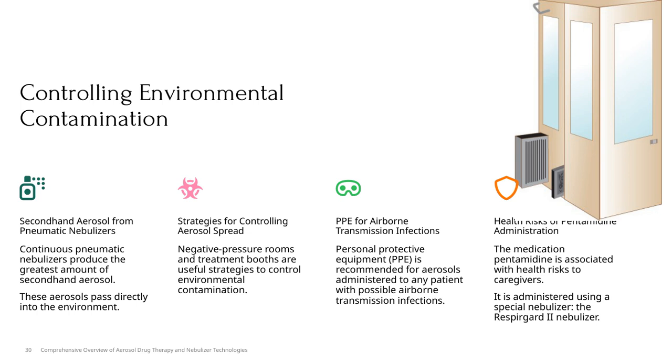This brings us to personal protective equipment, or PPE. It's essential to wear appropriate PPE whenever administering aerosols to patients who might have airborne transmission infections. Proper PPE acts as a barrier, reducing the risk of inhaling contaminated aerosols and protecting healthcare providers.